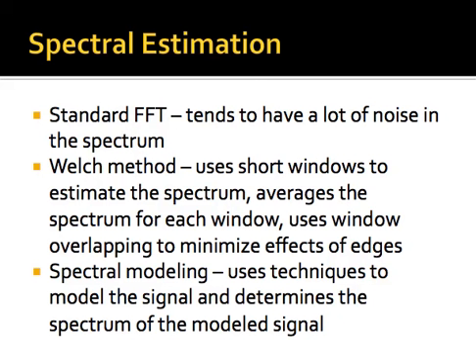Normally, if you picked a segment of your data and for your next window you didn't overlap the segments, you would find that the data on the edges of the window is zeroed out because of this windowing effect that we talked about previously. So that's a problem. So window overlapping is used to minimize those edge effects.